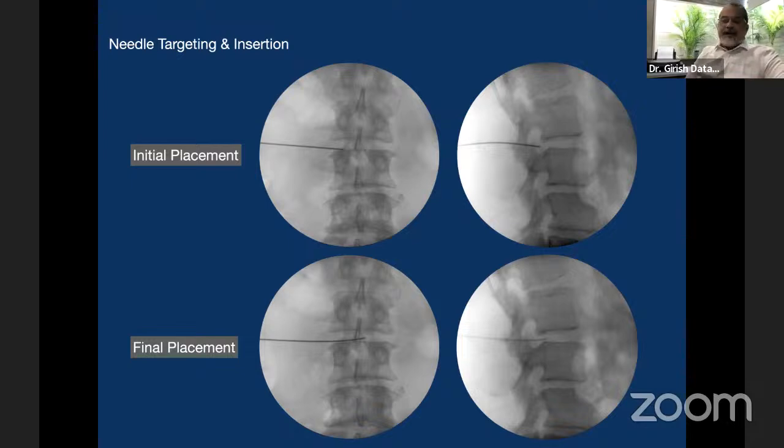Now, normally at L5S1 and L4-5, even if the herniation is not very big, you must enter at the medial pedicular line. But if the herniations are larger, you can enter medial to the medial pedicular line, and you are still safe, because the entire thecal sac along with the root is lifted dorsalwards. So you have a larger space. In fact, Kambin's triangle becomes larger in this patient.